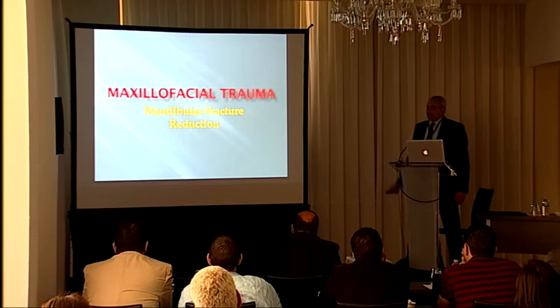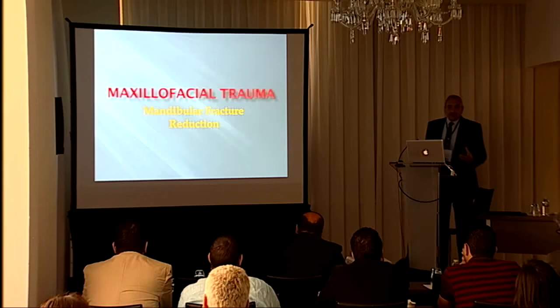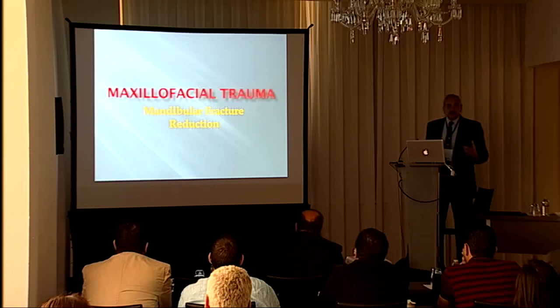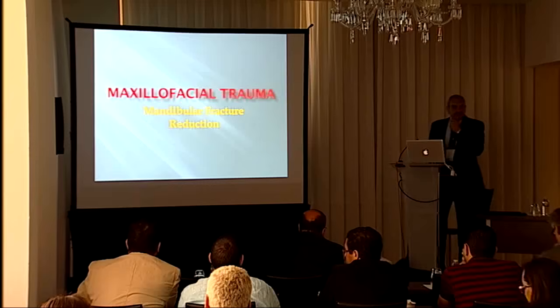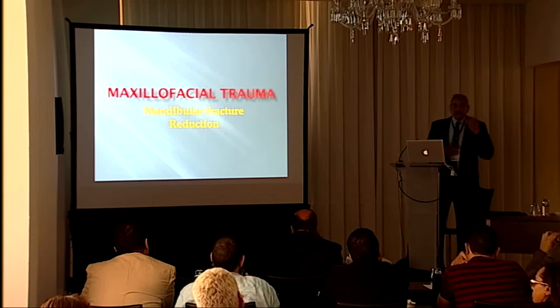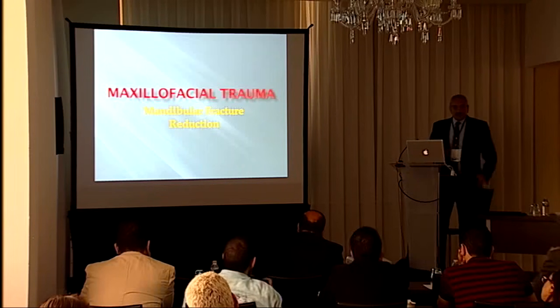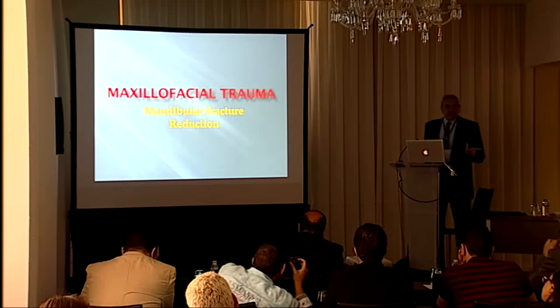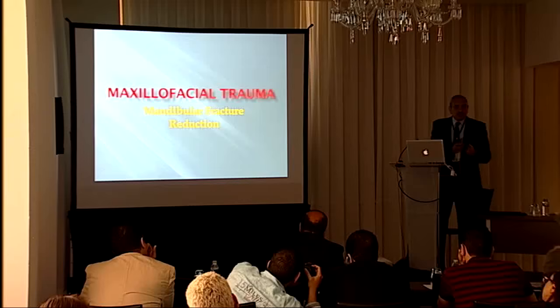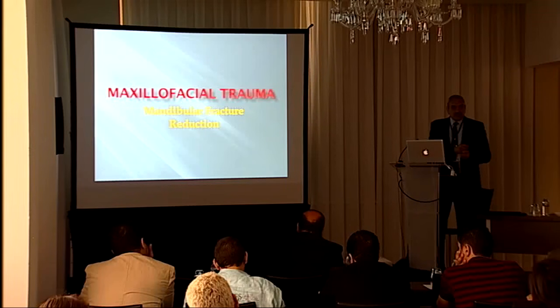For mandibular fracture reduction, sometimes we have a mandible that is broken, but the patient does not have enough teeth to fix the occlusion together in order to have what we call maxillomandibular fixation, to fix the mandible with closed methods, or we cut him open and fix it with bone plates and screws. Sometimes we do not have enough teeth to do that, so we're doing that manually, and we end up with small disturbances in the bite, and we say, okay, no problem, the denture would correct that.